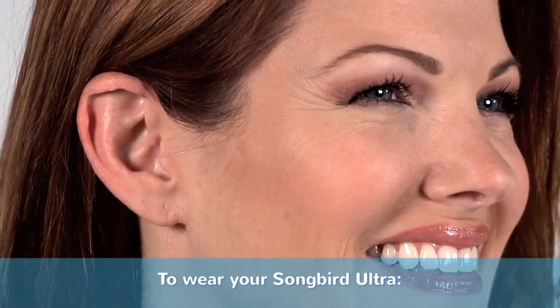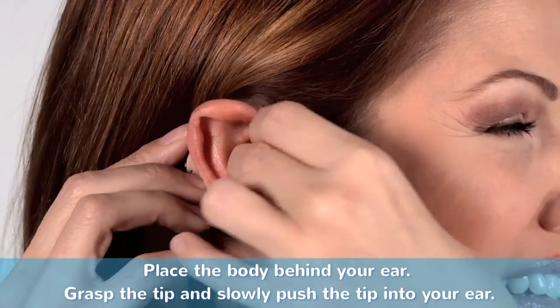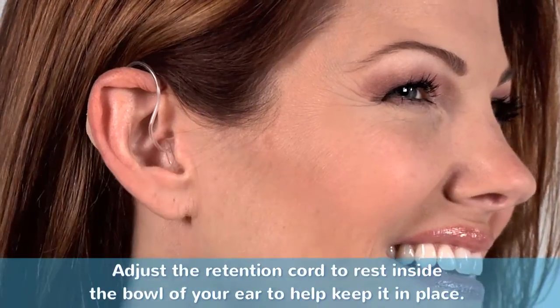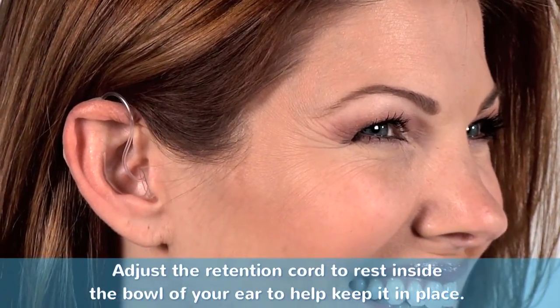To wear your Songbird Ultra, place the body behind your ear, grasp the tip and slowly push the tip into your ear. Adjust the retention cord to rest inside the bowl of your ear to help keep it in place.